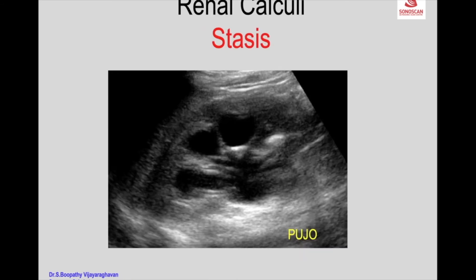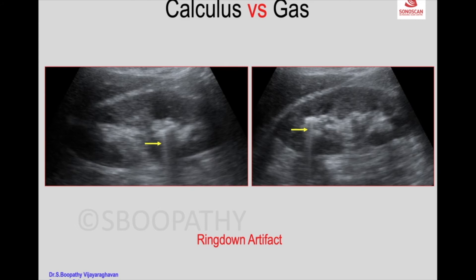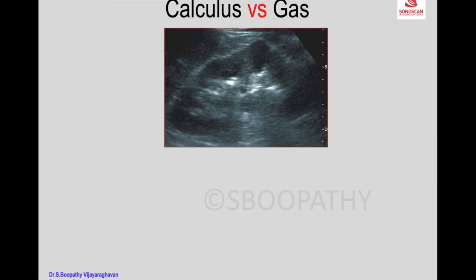The little calculi may be due to stasis. There is congenital PUJ obstruction with hydronephrosis, and there is calculus formation in the calix. With a calculus, you get the acoustic shadow — that is one of the differences. But sometimes it may not produce a shadow.